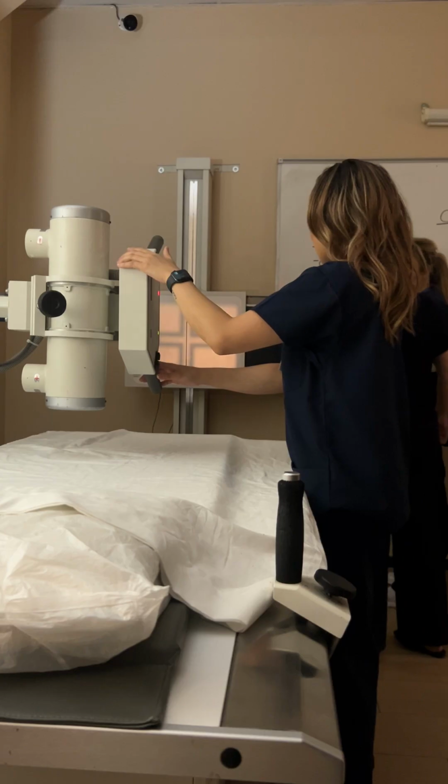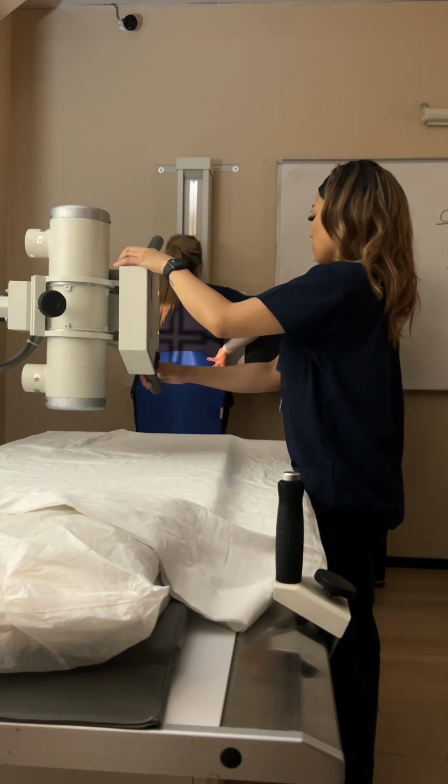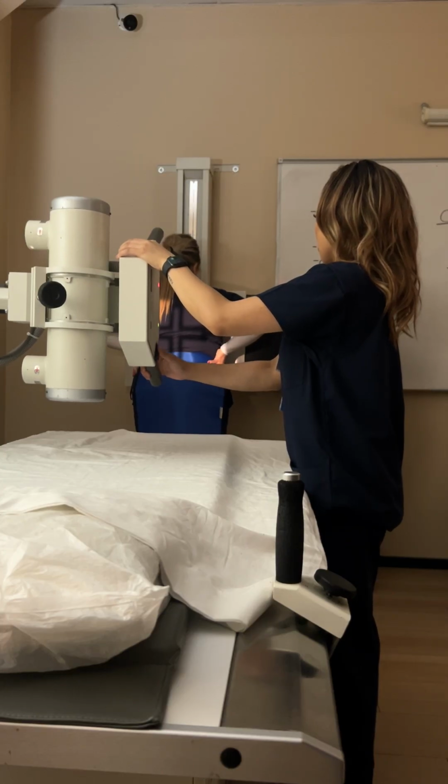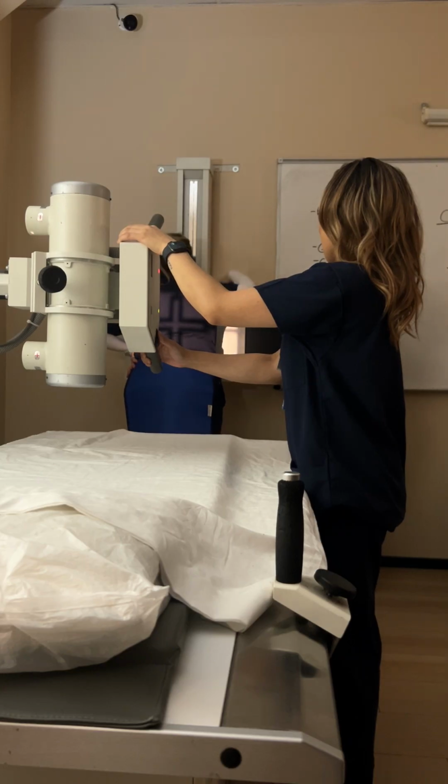Okay. And then just go put your chest on the board. Okay, now bring it up. Shoulders are good.